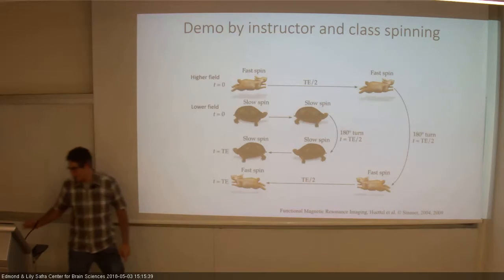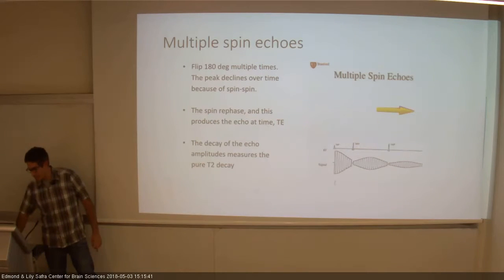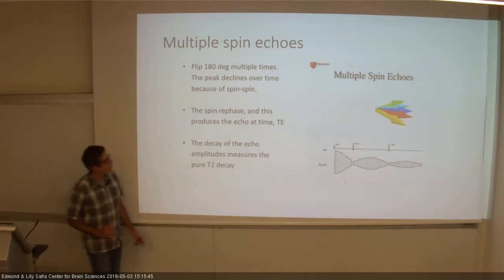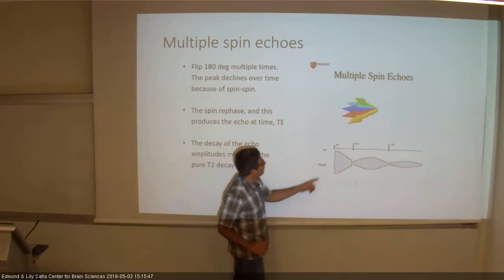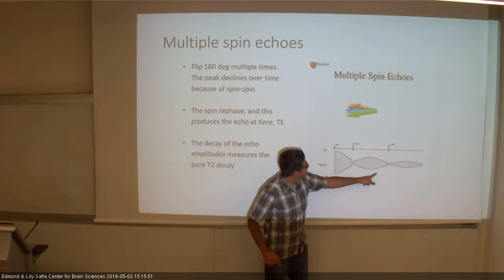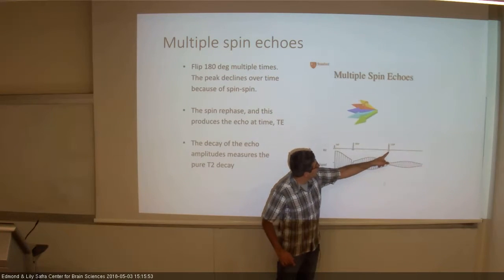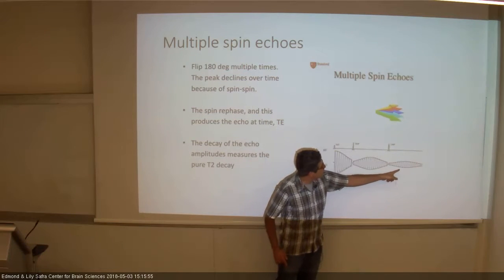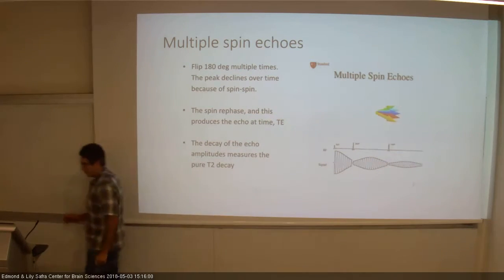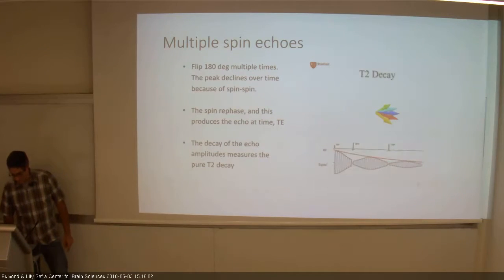And this is the movie of that. So they dephase, and then you flip them, and then there will be a moment in which they are in echo, and then they die, they're almost dead. They will be here at 180, and so they're going to rephase again.